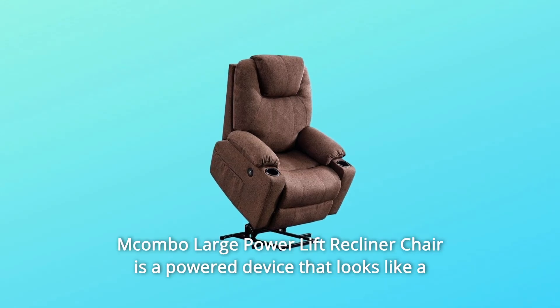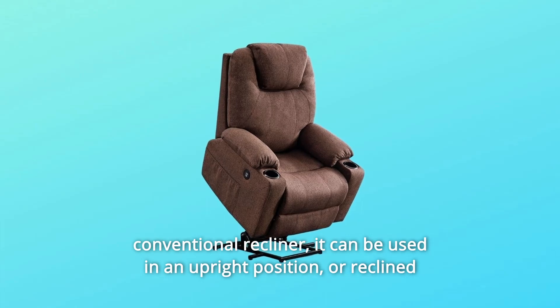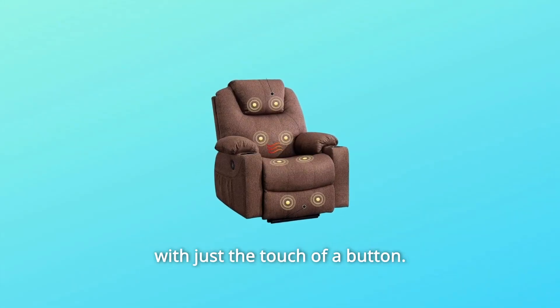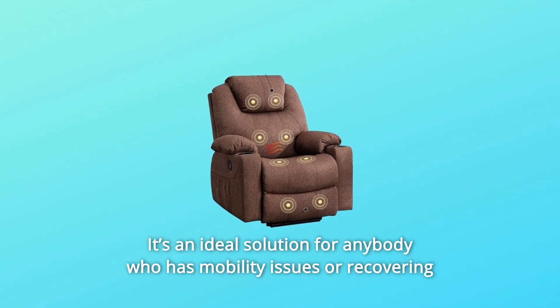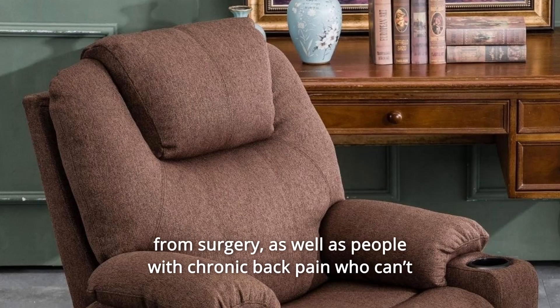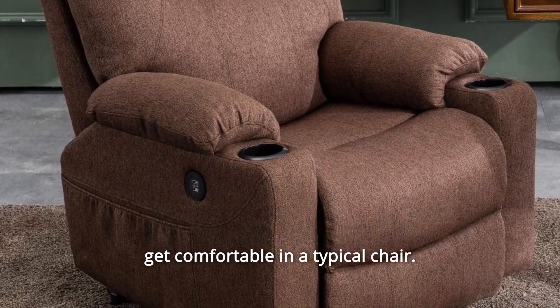Mcombo Large Power Lift Recliner Chair is a powered device that looks like a conventional recliner. It can be used in an upright position or reclined with just the touch of a button. It's an ideal solution for anybody who has mobility issues or is recovering from surgery, as well as people with chronic back pain who can't get comfortable in a typical chair.